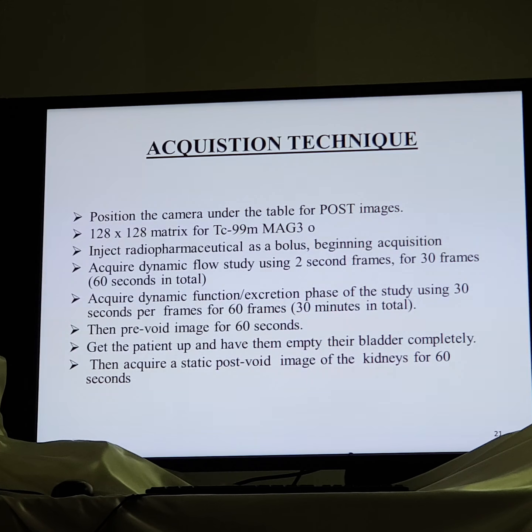Then we will inject the patients. As we said, with bolus injection, acquisition should start immediately. We acquire the flow, or dynamic flow study, using 2-second frames for 30 frames. The total will be 1 minute.